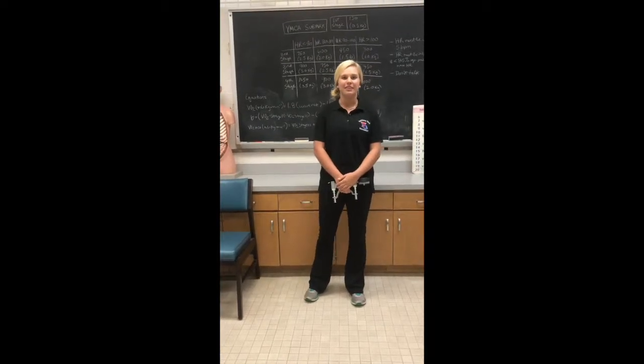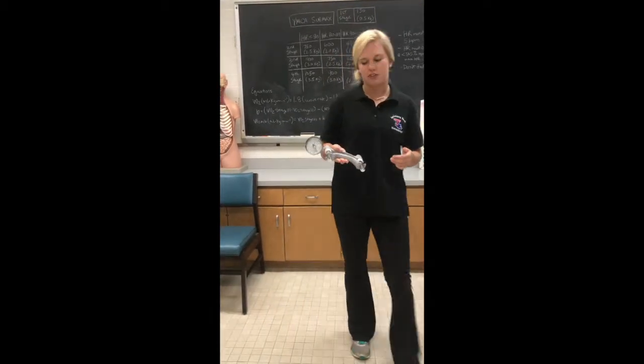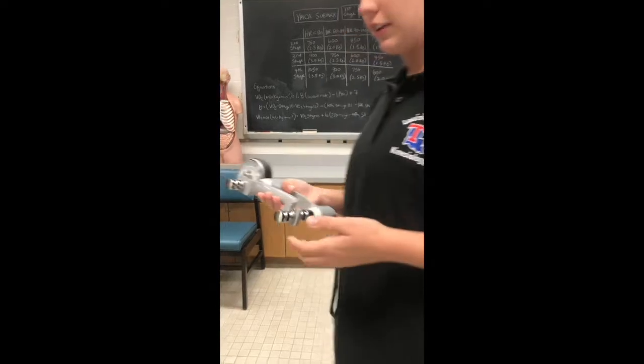Today we're in the Applied Physiology Lab here at Louisiana State University. We'll be going over the protocol for the hand grip strength test using a Jamar hydraulic dynamometer. Before we get started, we'll show you how to use it and how to set it up.